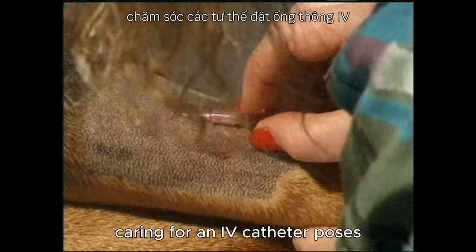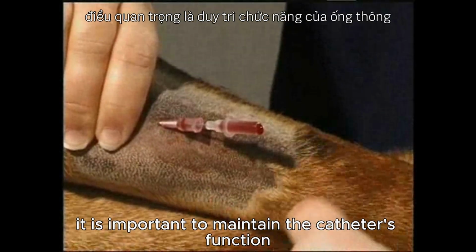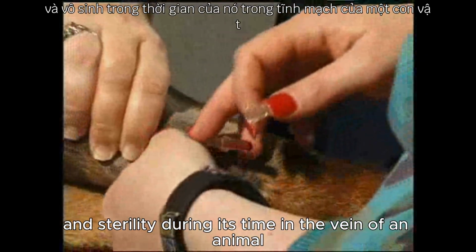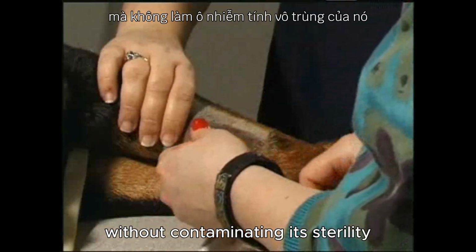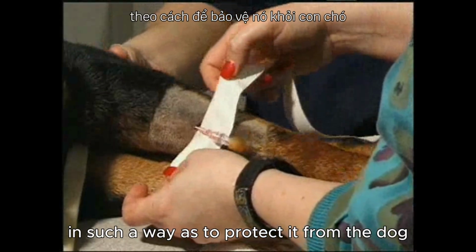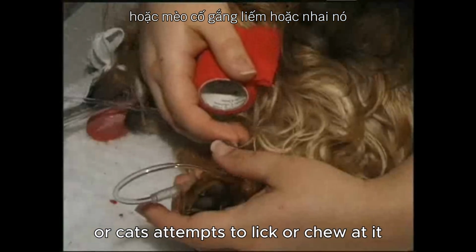Caring for an IV catheter poses yet another nursing concern. It is important to maintain the catheter's function and sterility during its time in the vein of an animal, without contaminating its sterility. It should be bandaged in such a way as to protect it from the dog or cat's attempts to lick or chew at it.